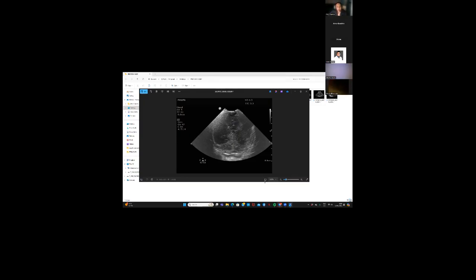Well done. So this is at the level somewhere, but I think we can see the third ventricle. It's a little bit tricky, but I can definitely see a midline cystic structure, which I think is the cavum. And then the right ventricle with some choroid is definitely visible. But good depth, you've got the whole brain. And from the parenchyma, I can't see any areas of hyperintensity so far.